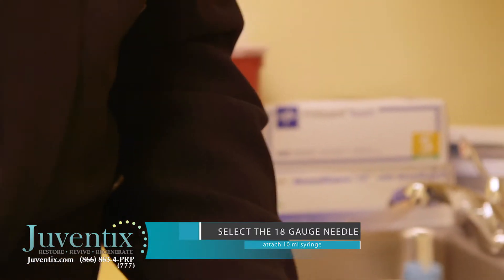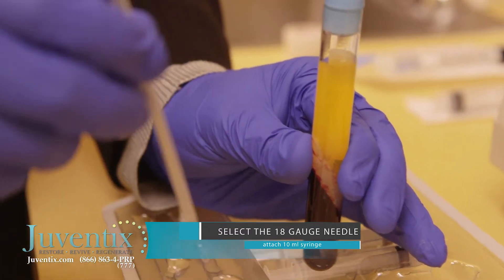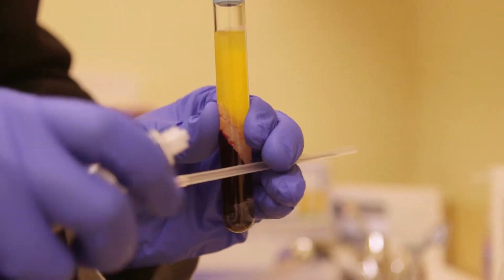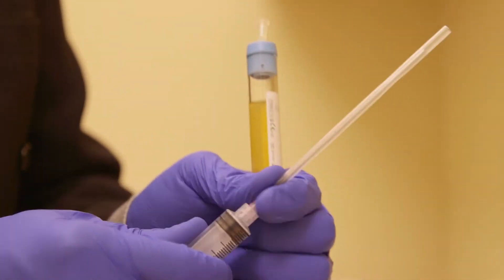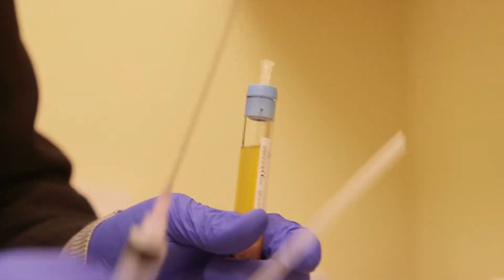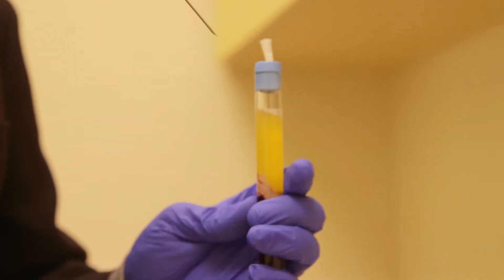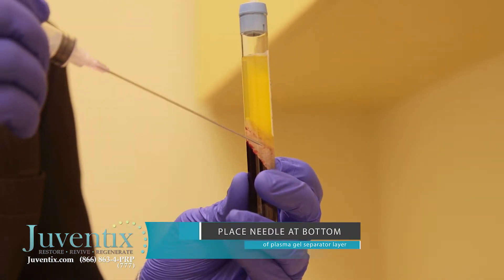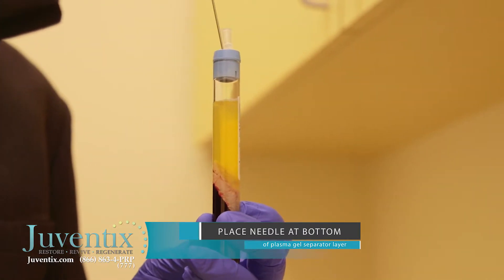We're now going to take our 18 gauge spinal needle, which we're going to use to collect our blood plasma. We're going to attach it to our 10 ml syringe, nice and firm, and remove our protective cover. We're now going to insert this into the vial, with the goal of aiming towards the lowest portion of the polyester gel layer to capture as much plasma as possible.